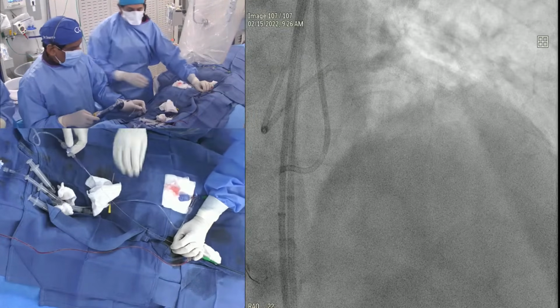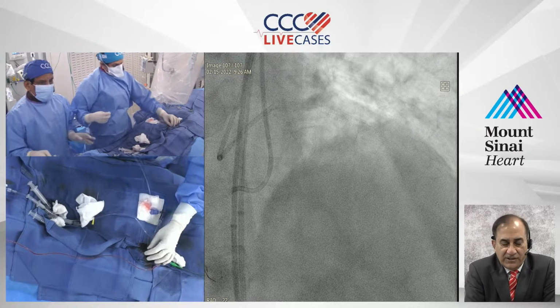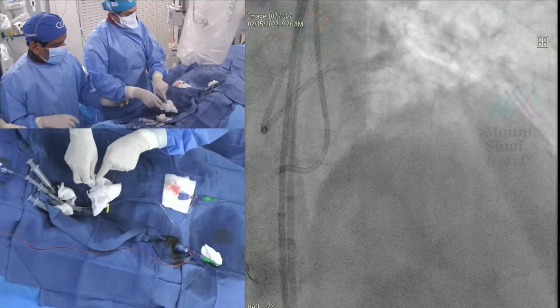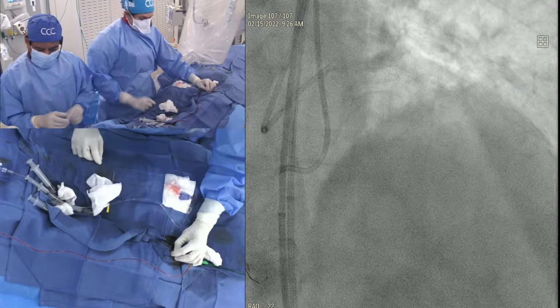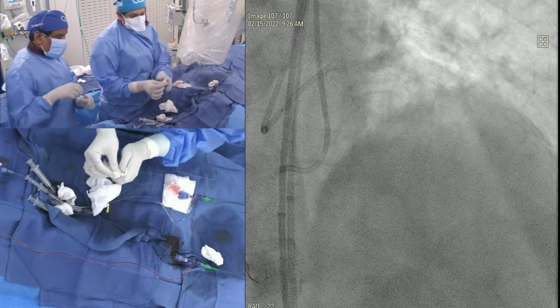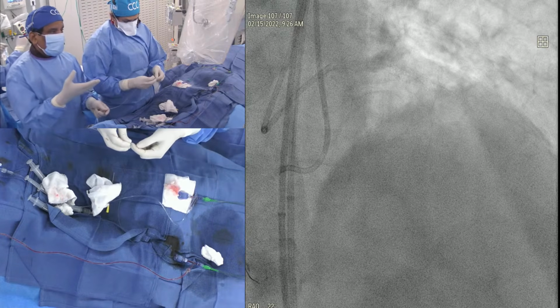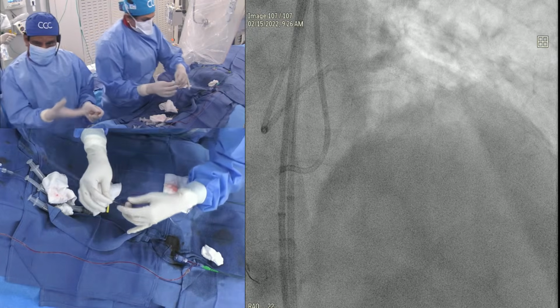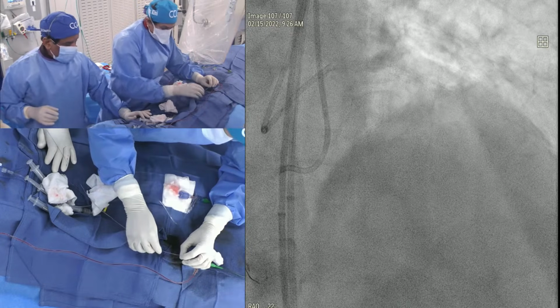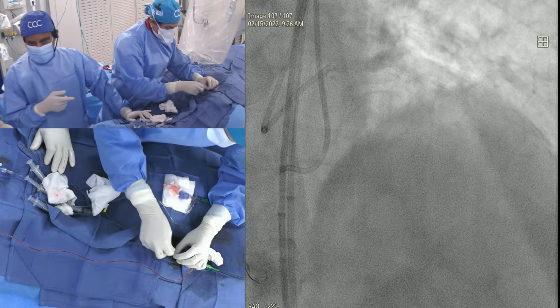Okay, take this out. There is a question and a suggestion. The question is how much is the ACT? The suggestion is perhaps do a reverse CART. First we need to get some device further down. For reverse CART, you're doing a controlled antegrade dissection, but we need to get our device into the septal collateral and then the main vessel. The calcium of that LAD and the stent is not allowing any device to go into the septal. So reverse CART cannot happen yet till we get our balloon that far.